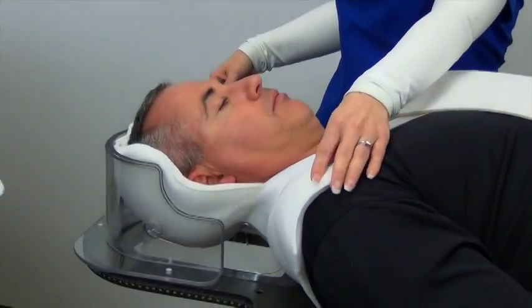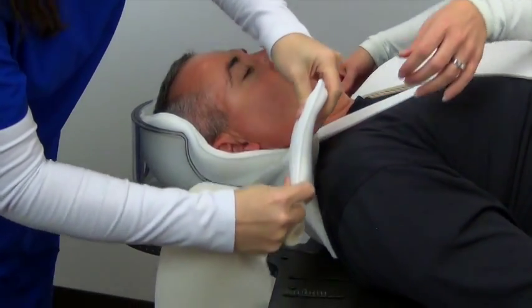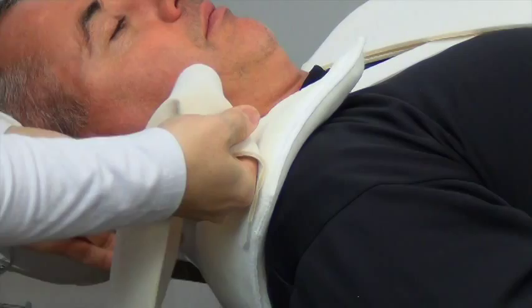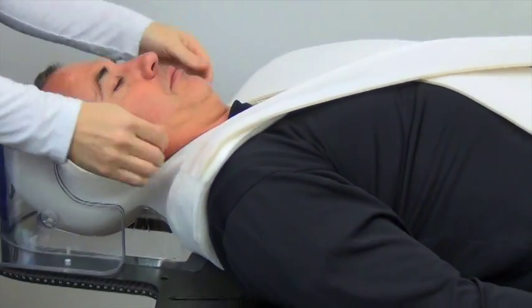Repeat the process on the other side. Begin to mold the cushion around the patient's shoulders. Place the larger 6 inch strap on the cushion over their shoulder, pull tight over their torso, and attach to the Velcro on the side of the couch, doing the same for the other strap.